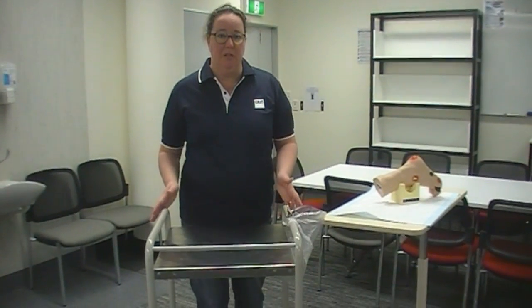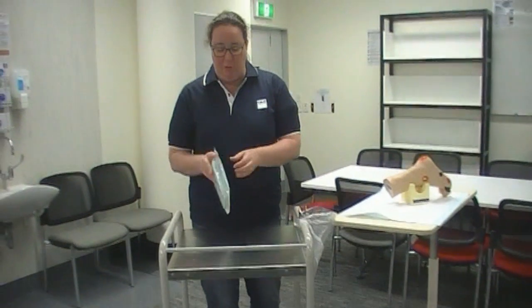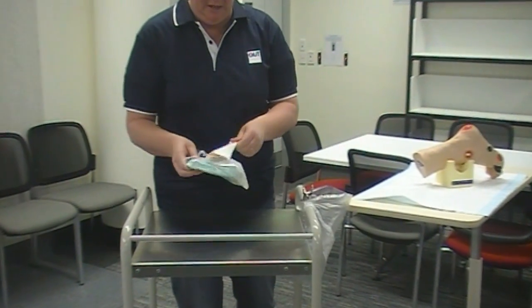I've wiped my trolley down to make sure that it's nice and clean, and I've also done a social hand wash just to make sure my hands are clean before I do the setup. To set up I first grab my dressing pack from the bottom of the trolley, which is where I keep all my equipment so that it's not in the way.